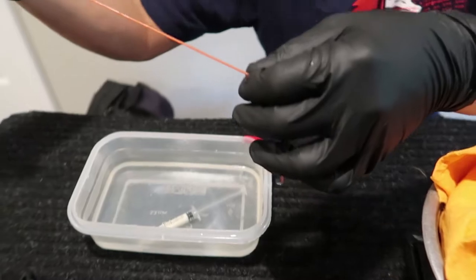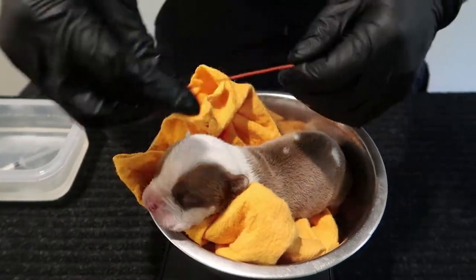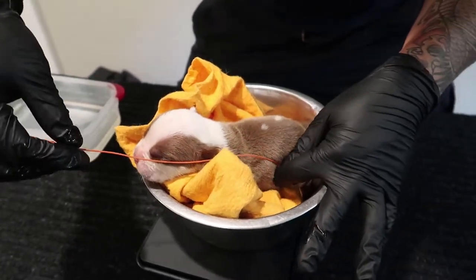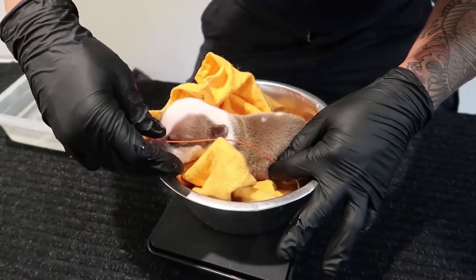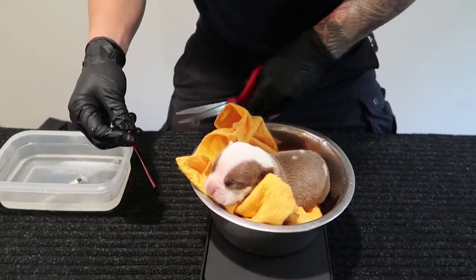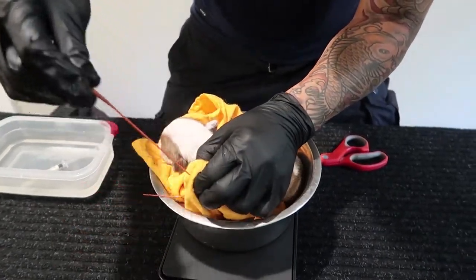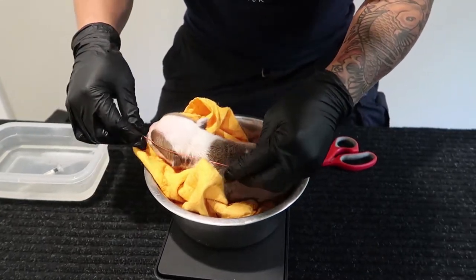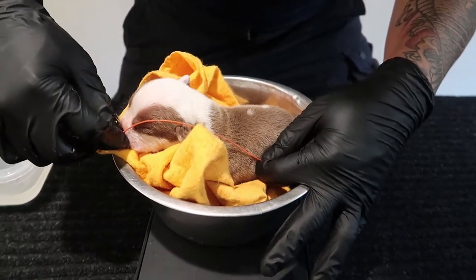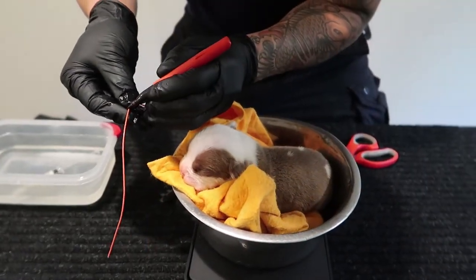We're going to use our catheter — here's how to measure it. You measure from the tip of the nose to the back rib. I'm going to give it a little extra; the back rib is about right here — that's where the stomach is going to be. So I'm going to cut it right here. Then I'm going to make a mark. From the tip of the nose to the back of the rib — it'll be right about there. You want it to go in that far, so I'm going to use a marker and just mark it.